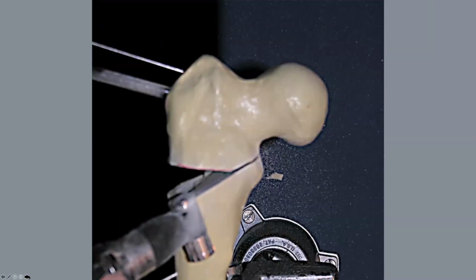Sometimes you have to externally rotate the femur because the length of these small oscillating saws may not be quite long enough, especially if somebody has remodeled and formed some bone on the medial aspect. So you may have to actually rotate a little bit in order to complete that cut. Use the saw blades that are extremely thin. The ones that I use are 0.6 millimeters thick. And this one that you see here has a little measuring guide on it.